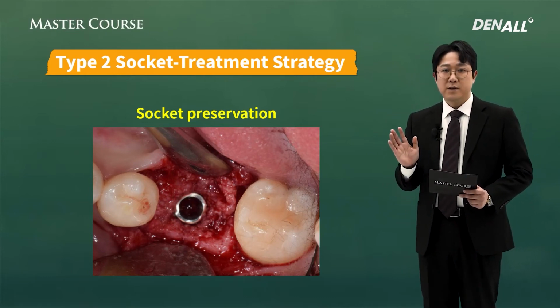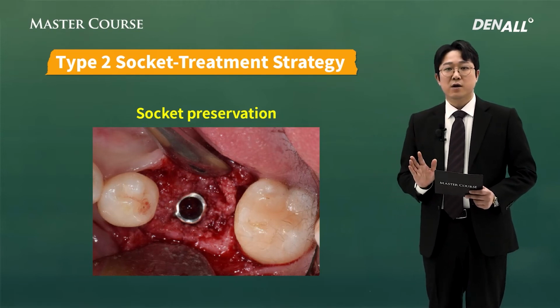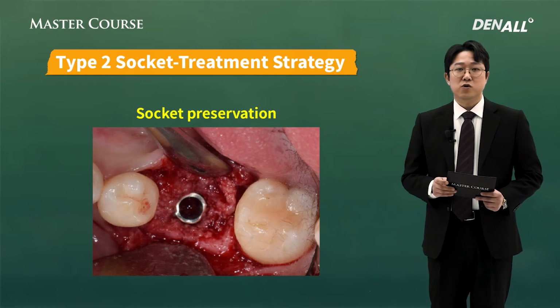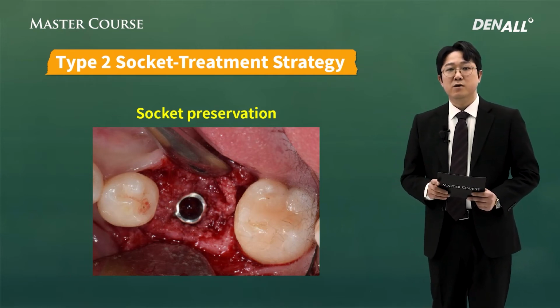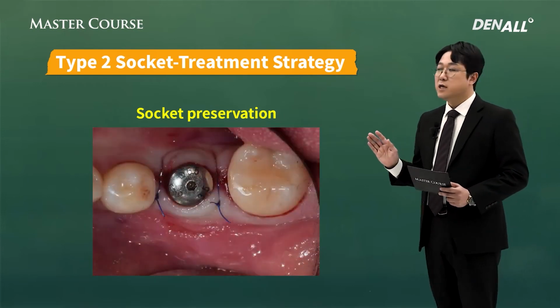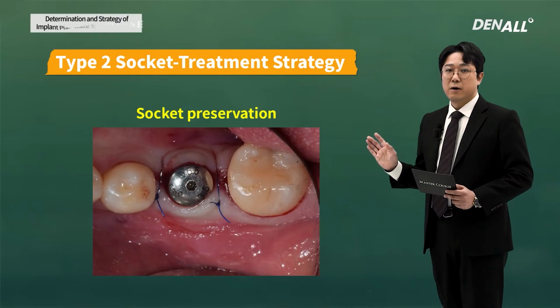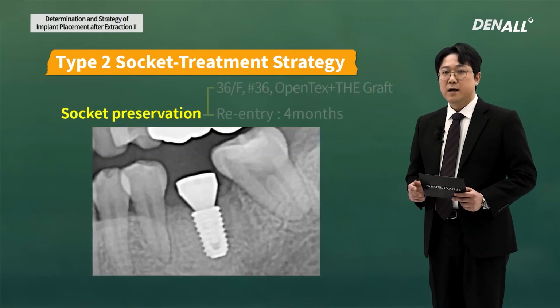However, the bone in the socket looks like woven bone. So you should do under drilling and do drilling as you do in an autogenous bone to get initial stability and place the implant. Initial stability was approximately 30 Newton centimeters, so 1-stage surgery was done.